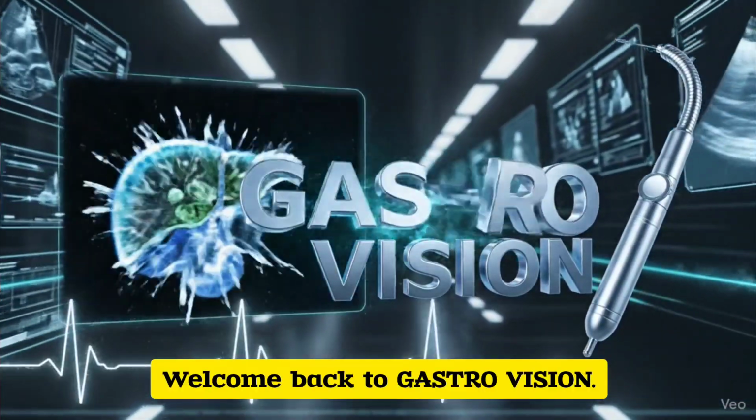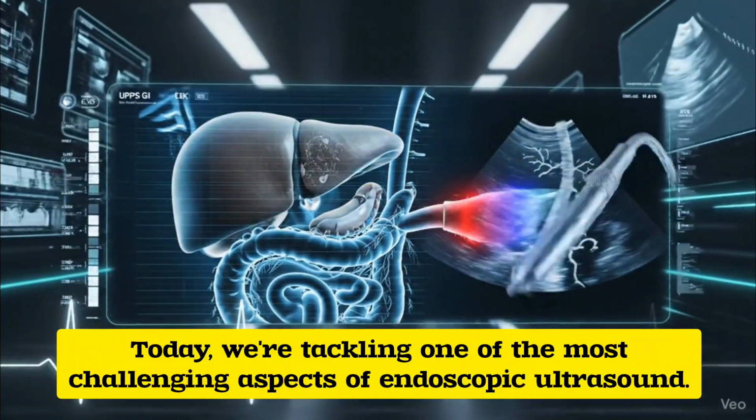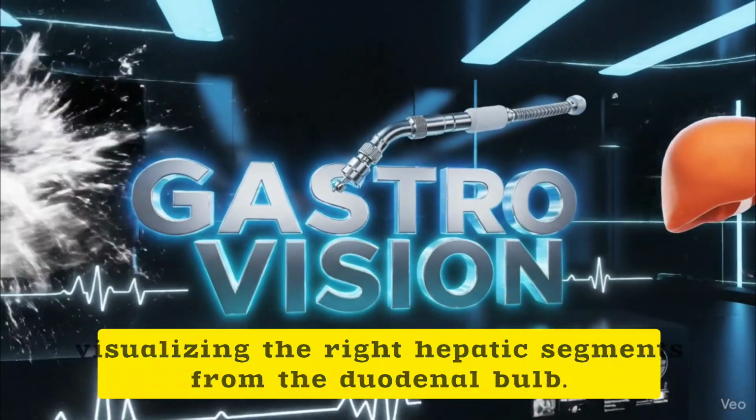Welcome back to GastroVision. Today, we're tackling one of the most challenging aspects of endoscopic ultrasound, visualizing the right hepatic segments from the duodenal bulb.